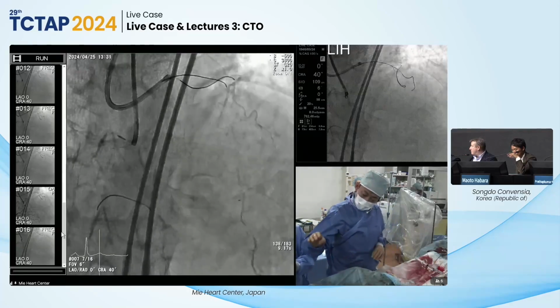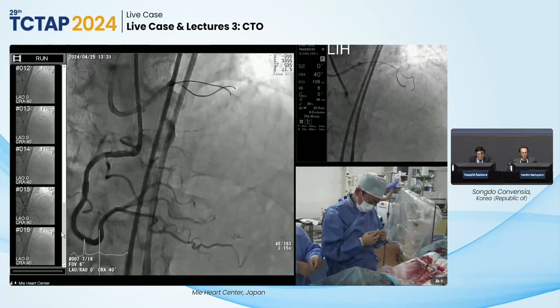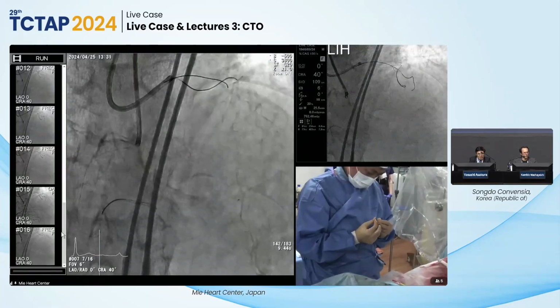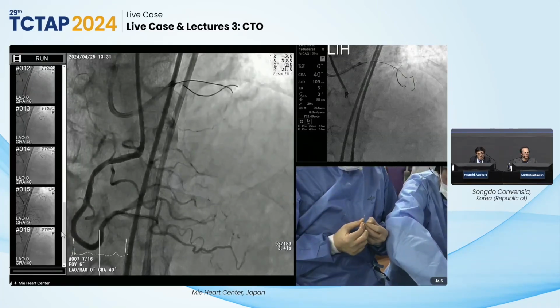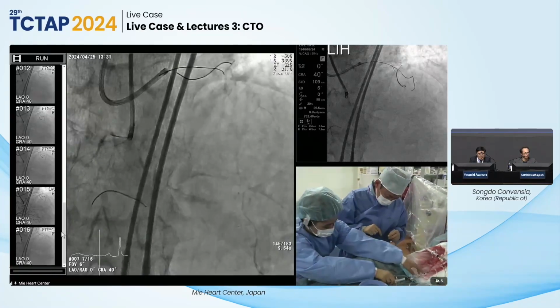So now my Gaia Next one is very slipping to the diagonal side. So I changed to the Gaia Next 2, changed the direction. And you need an additional bend, right? Because the angle is quite steep. You have to puncture to 6 o'clock. What I've seen, the Gaia wire, the first was going to 5 o'clock or 5:30, between 4 and 5 o'clock. You couldn't puncture down directly.